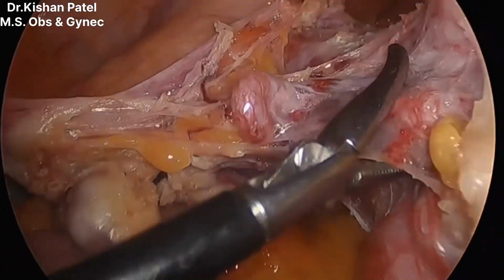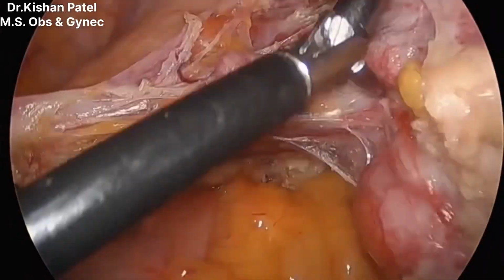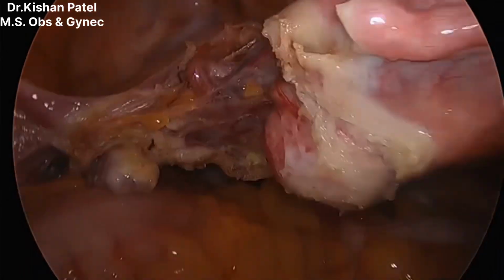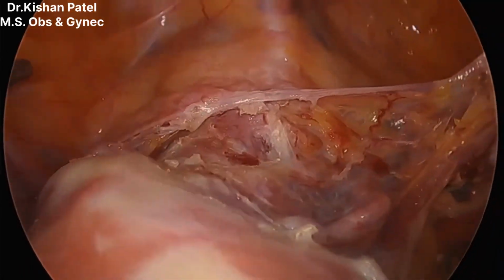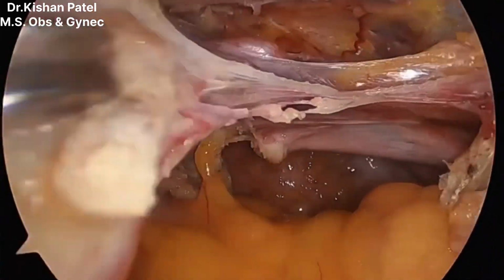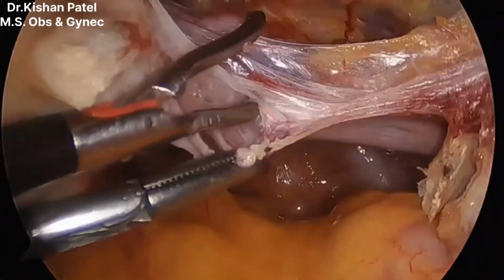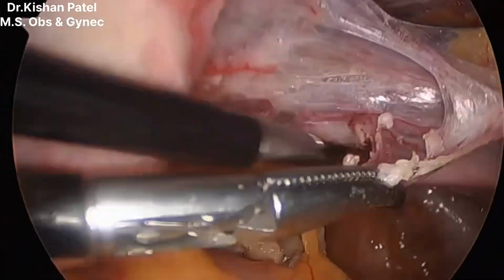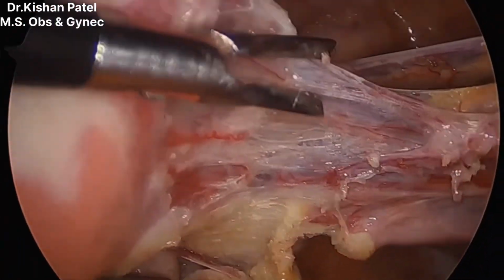Okay, so we are safe to coagulate and cut the uterine artery now, as we have separated the urinary bladder from the uterus. As well as on the opposite side, we will skeletonize the uterine artery and the vein, so we can separate it down, stretching and coagulating and cutting with a shearer.